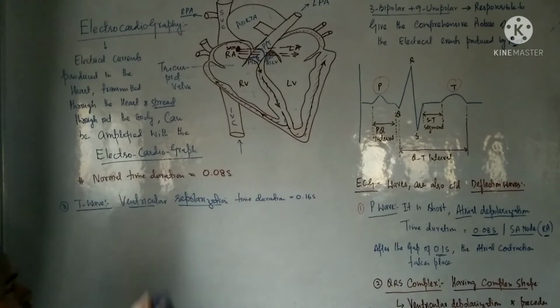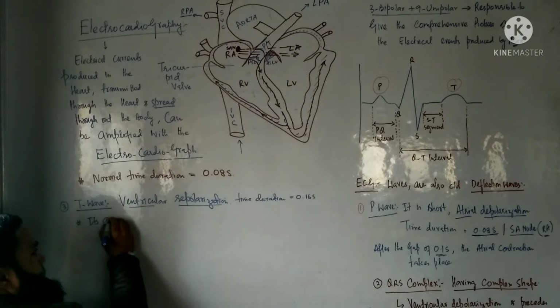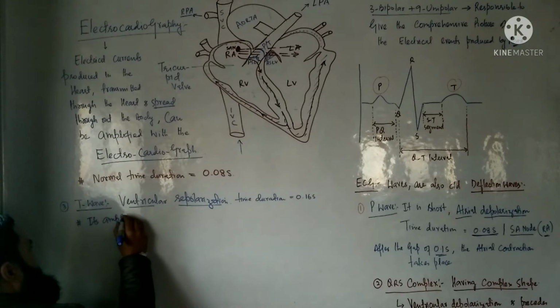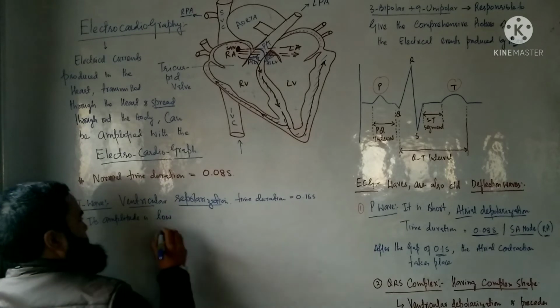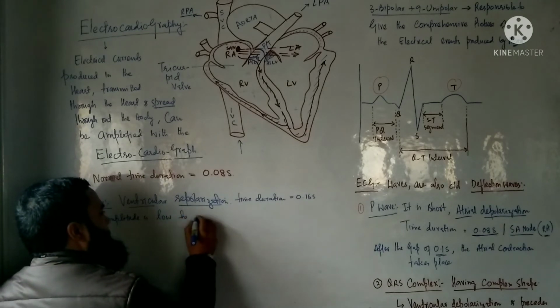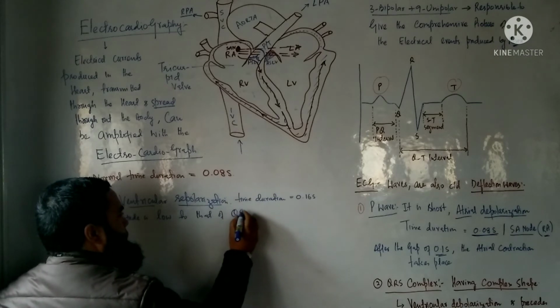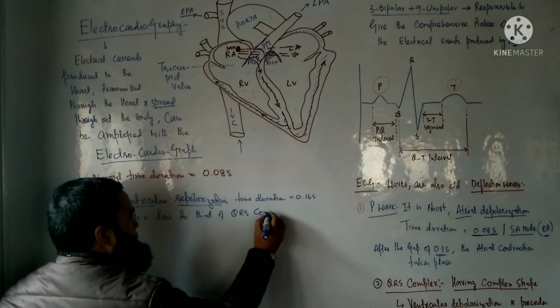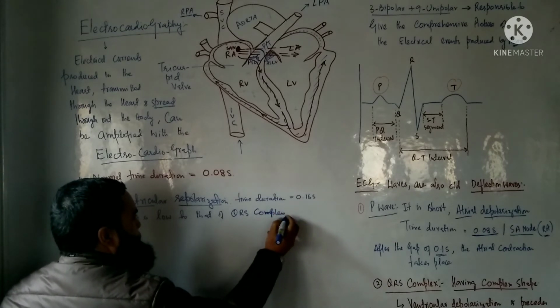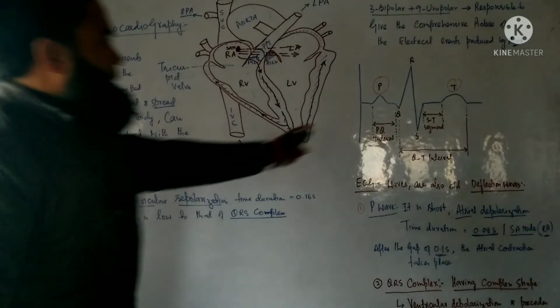Its amplitude is low compared to that of the QRS complex.